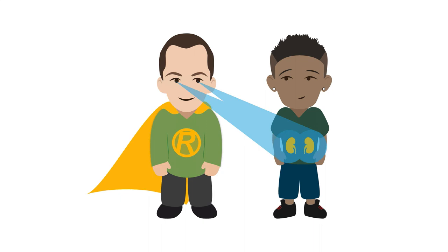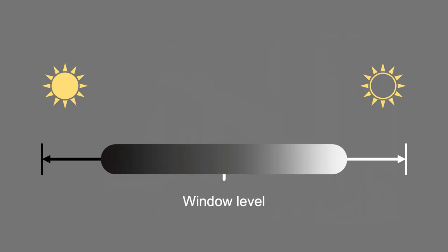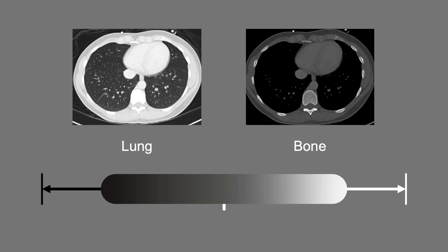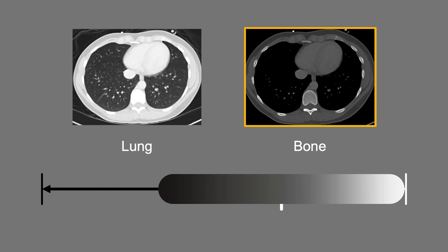Changing the window level or center point essentially makes the whole image brighter or darker. However, the biggest difference can be seen between the lung and bone windows. When viewing bones, the midpoint is higher because you want the center of your grayscale values to optimize your ability to evaluate denser bone. In this case, the level is about 300 Hounsfield units.